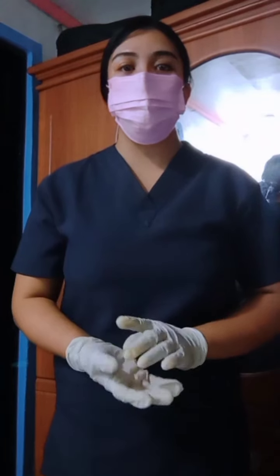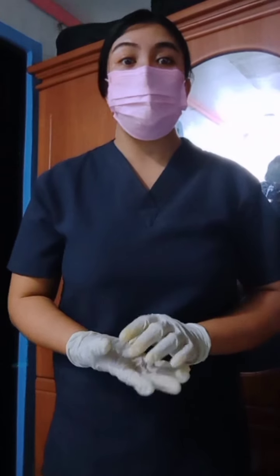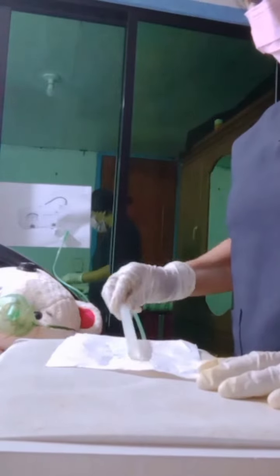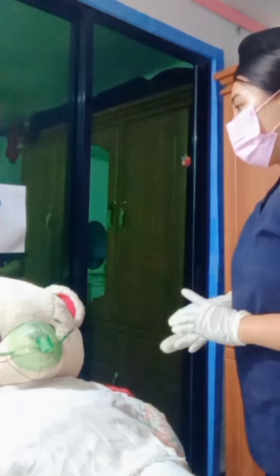Increase the patient's prescribed oxygen flow rate, instructing her to breathe slowly and deeply. Lightly coat 6 to 8 centimeters or 2.4 inches to 3.2 inches of the distal end of the catheter with a water-soluble lubricant. Mom, I'm going to go ahead and suction down your nose into your lungs to help get out some of those secretions. Using your non-dominant hand, remove the oxygen delivery device as you ask the patient to inhale deeply.